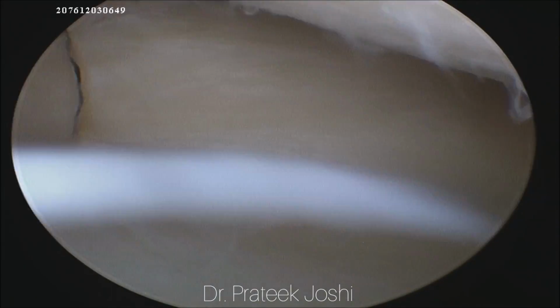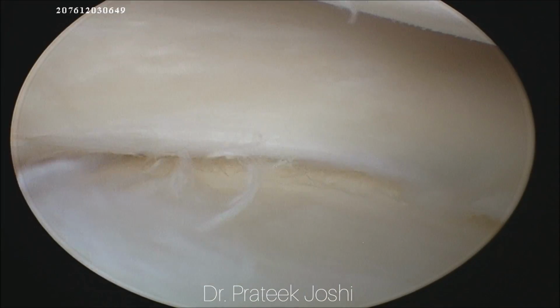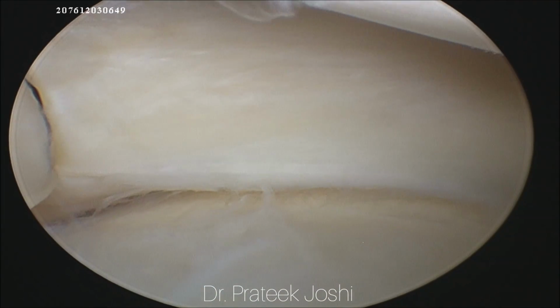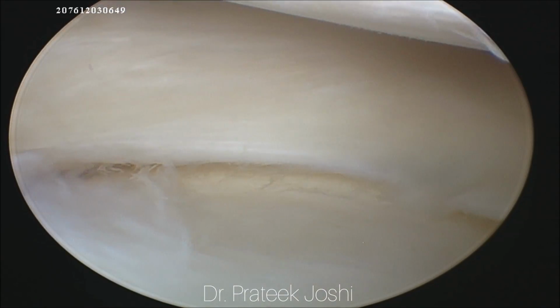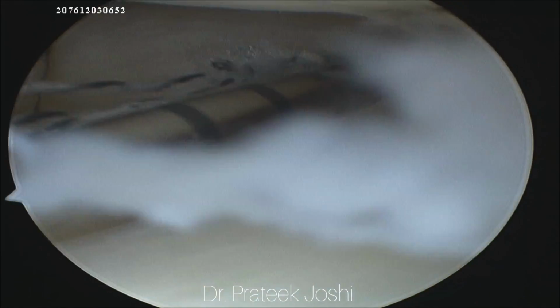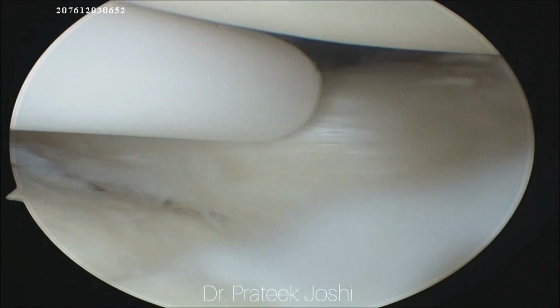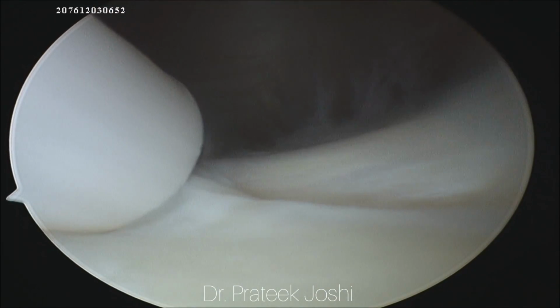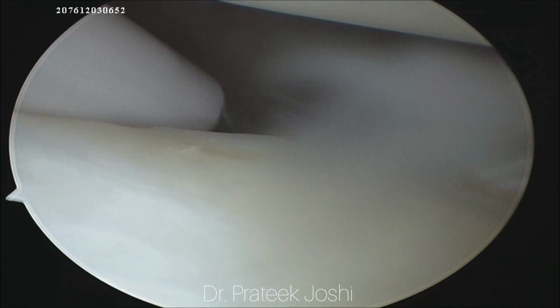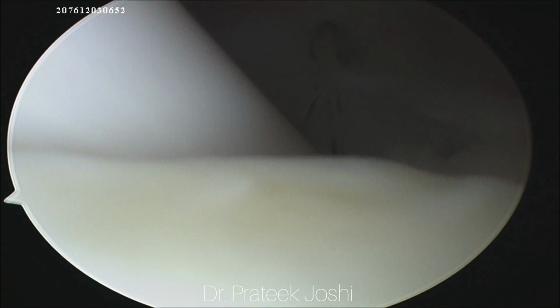Now I am going to change my viewing portal from anteromedial to anterolateral, and I am going to insert my second all inside device from the anteromedial portal. As you can see right now, I have inserted my second all inside device superior to the lateral meniscus and just posterior to the tendon of the popliteus.